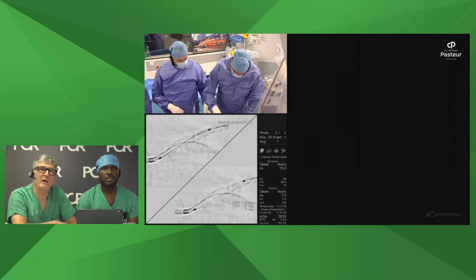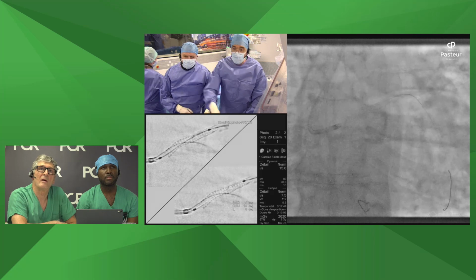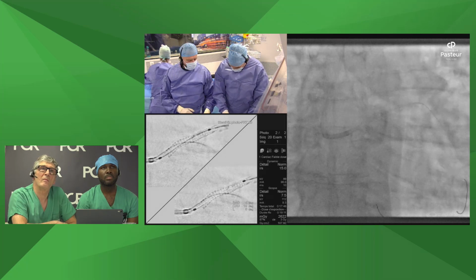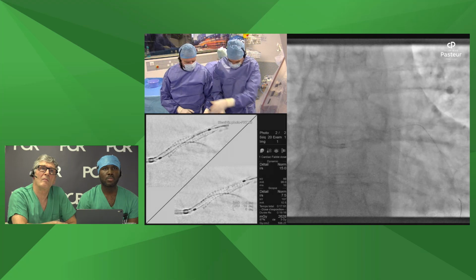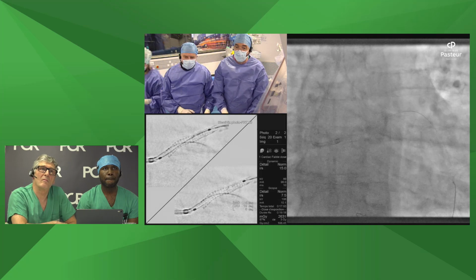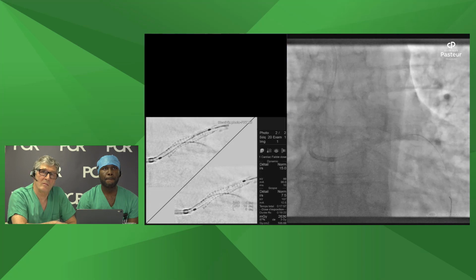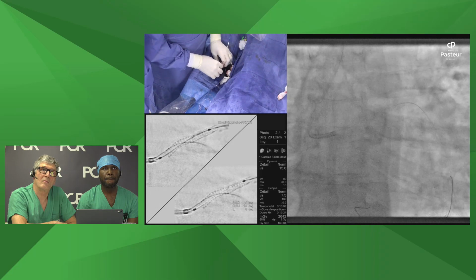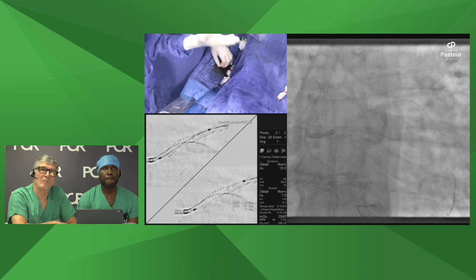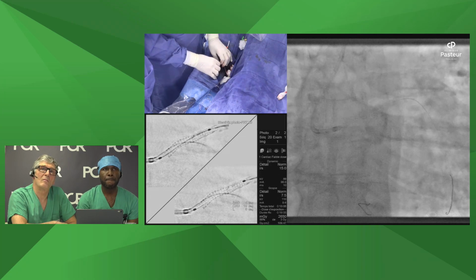Jean, can you explain also how you control the guiding catheter to avoid the longitudinal compression of the stent? Yeah. So what we do all the time, we push on the wire, and particularly the LCX wire, in order to avoid, particularly when we remove the balloon from distality to the catheter, the risk of the balloon diving inside the stent.